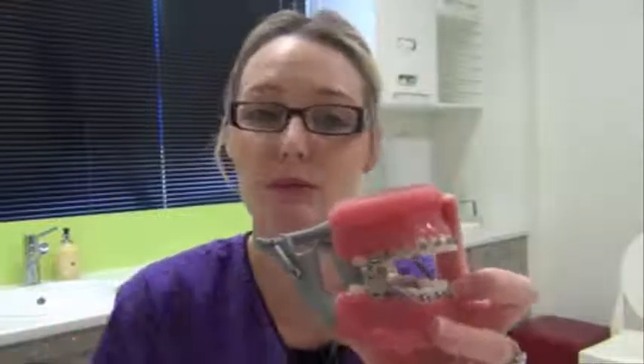If you are finding any of these areas uncomfortable, as with the braces when you first got them, don't be afraid to use some wax to help cover any of the sharp edges.